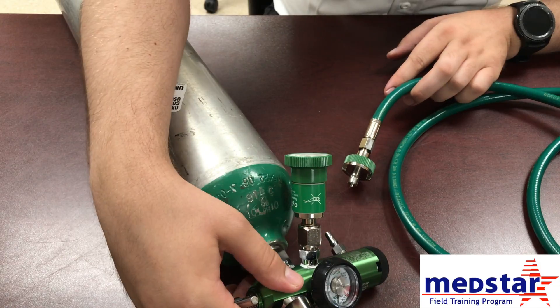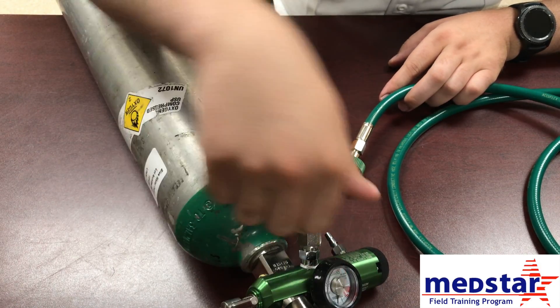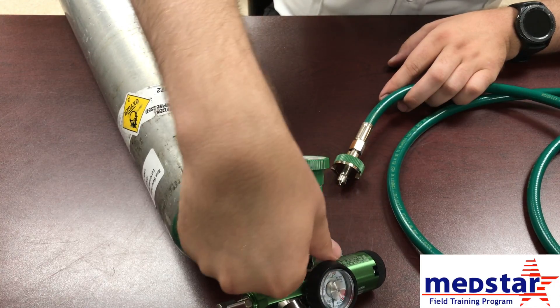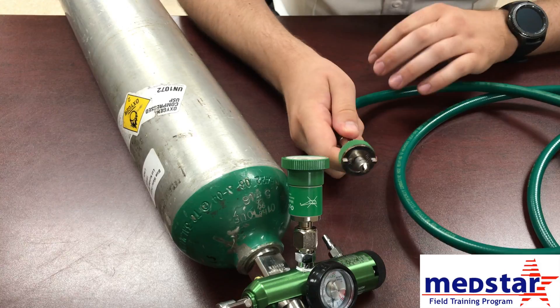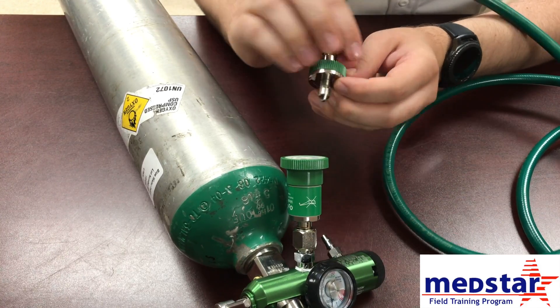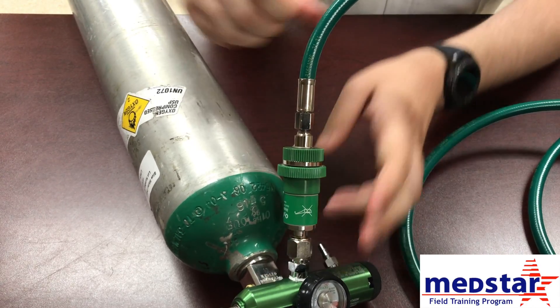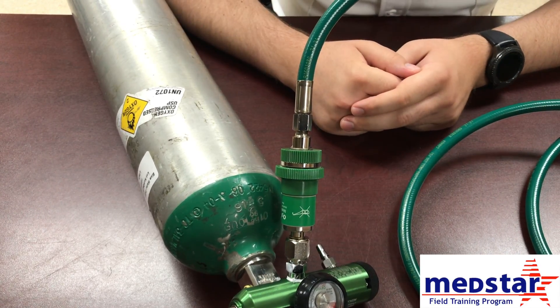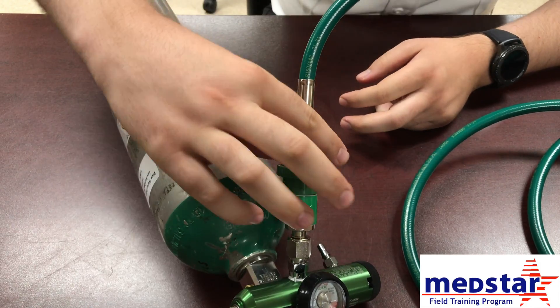Make sure your regulator is on and secured, your tank is turned on, and it has oxygen in it. Check for leaks with your high pressure connections — you can check for leaks here and again at the ventilator side. To connect, take the fitting, line up the prongs, and plug it into your oxygen source. You should hear it connect — your ventilator is now hooked up to oxygen. To disconnect, just twist and it will pop off.